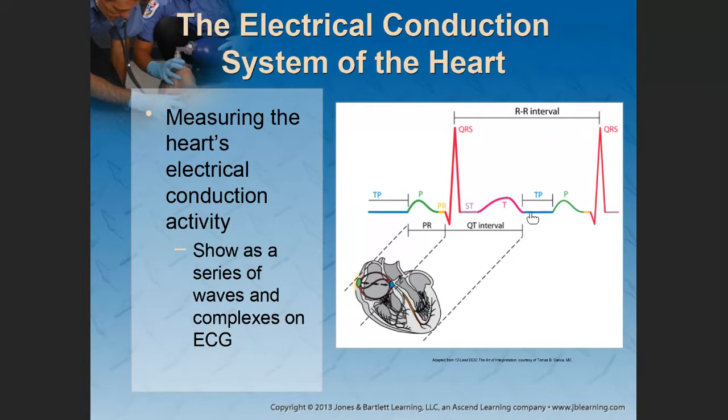Anything above the baseline is positive. Anything below the baseline is negative. So anything above the flat line is referred to as a positive waveform. Anything below is referred to as a negative waveform.